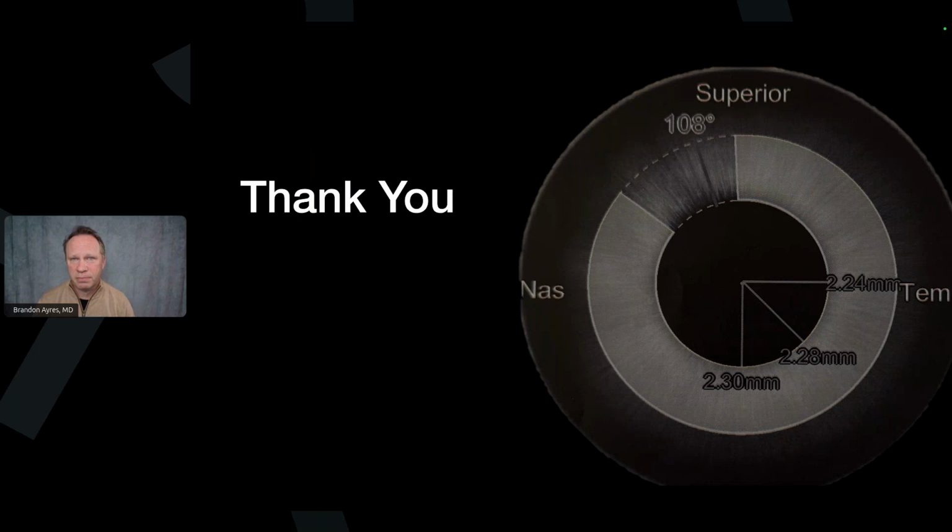Excellent answer. Could you elaborate a little bit? You mentioned that you typically go with the nomogram supplied by CorneaGen, but occasionally you might go a little thicker if you want more steepening. When, if ever, would you go thinner? I've never gone thinner. I've gone a little bit thicker sometimes.